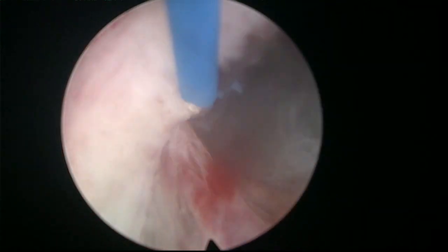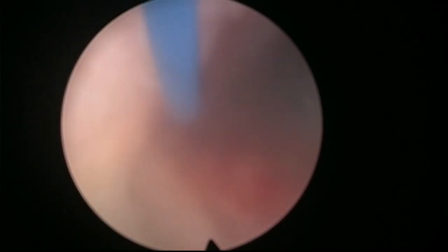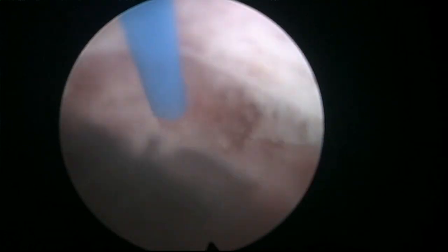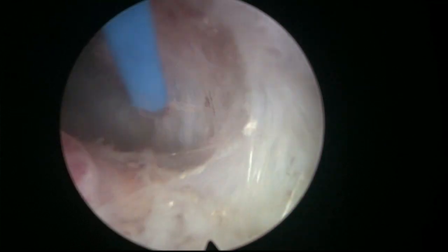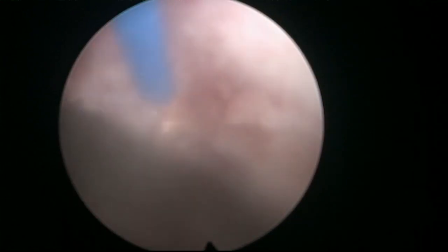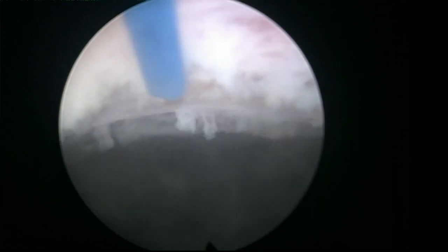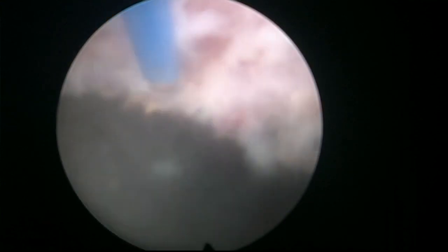It's bladder. Say again? You were always close, yes, but as we are now in the anterior aspect, for the moment we don't worry about that. But we'll have to check as we cut the bladder neck towards the posterior area. Here what I'm doing is trying to coagulate those vessels that were bleeding from the mucosa.